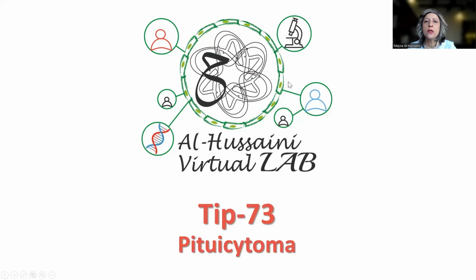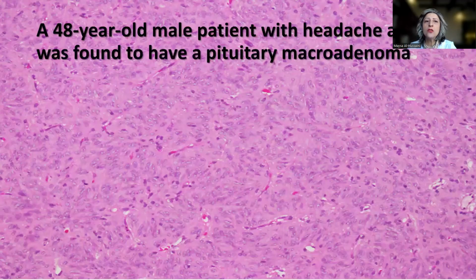What I'm going to be sharing with you today is a nice example of a posterior pituitary Pituicytoma. So this is a case of a 48-year-old male patient who presented with headache and who was found to have, on imaging, what was thought to be non-functional pituitary macroadenoma.